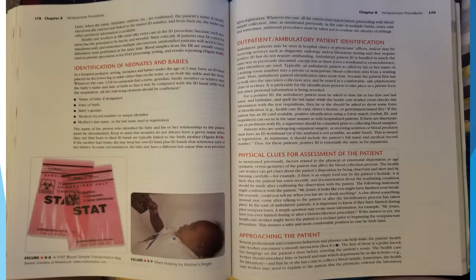Healthcare workers in ERs must take extra care in the ID procedure because each situation has the potential to be hectic and stressful. Many critically ill patients may be cared for simultaneously, and sometimes multiple unconscious, unidentified patients will need to have laboratory tests performed at the same time. Blood samples from the ER are usually considered as priority specimens or for stat processing, testing, and result reporting.